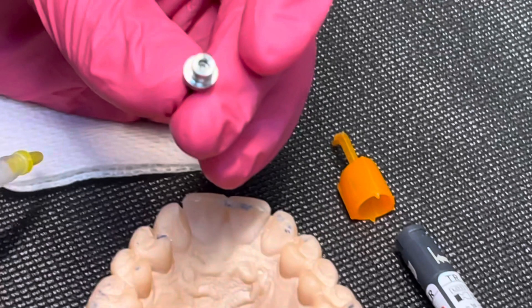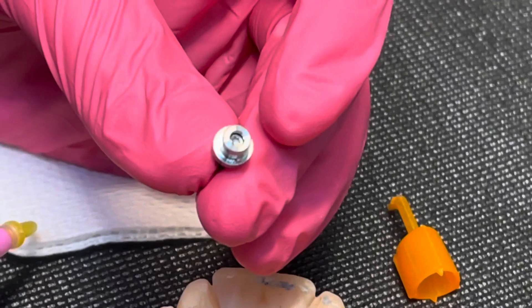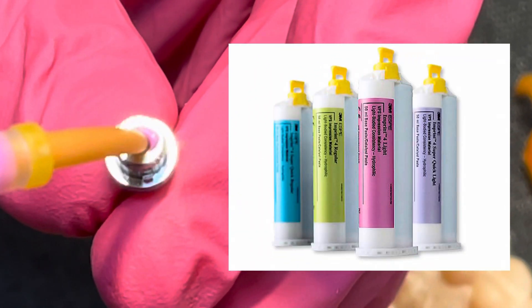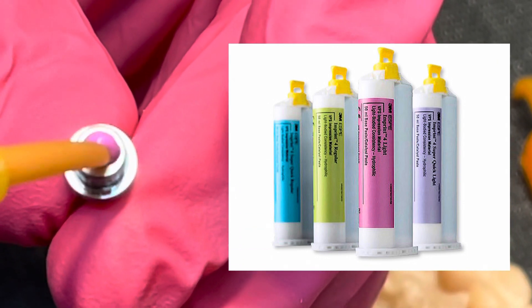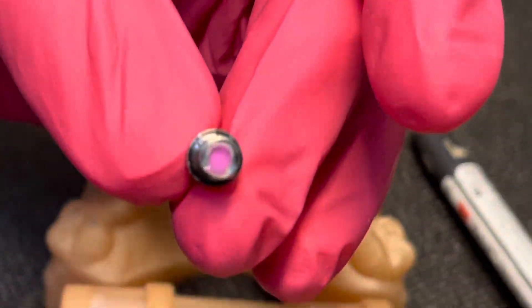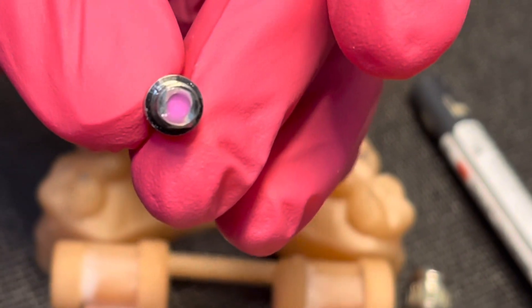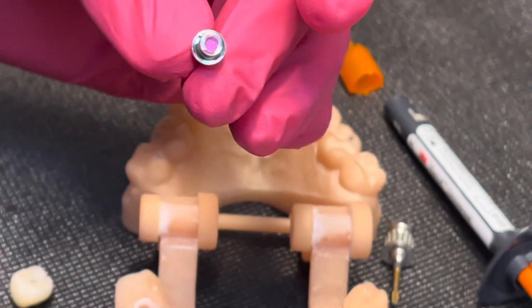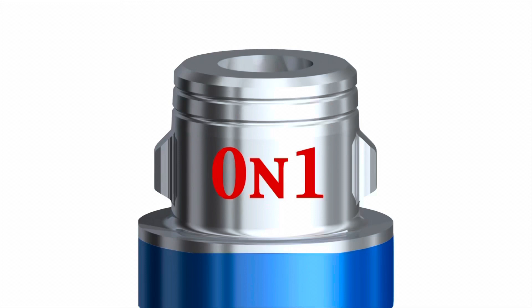We pull this out and take some Imprint 4 to put into the channel to block it out. You can use any color, but I like pink because I can see it really well when picking it back out after bonding. We then take a gauze and wipe it off so it's only on the occlusal aspect of this abutment, and we're ready for sandblasting.